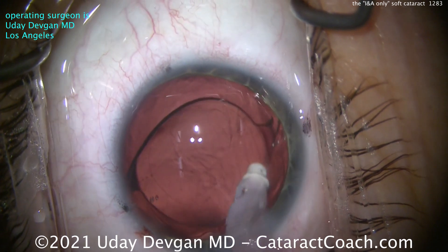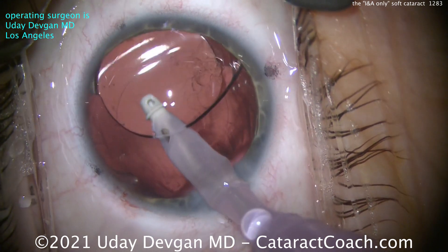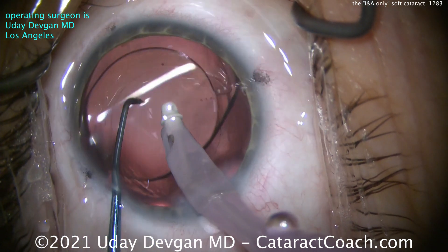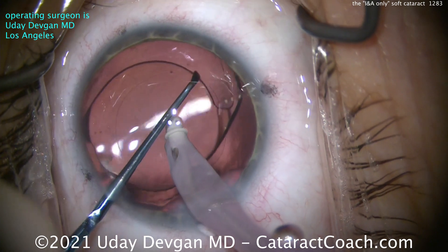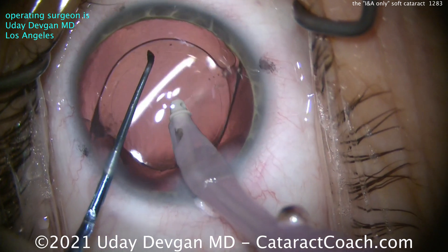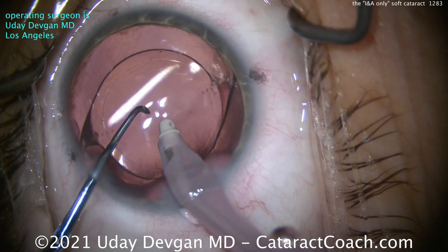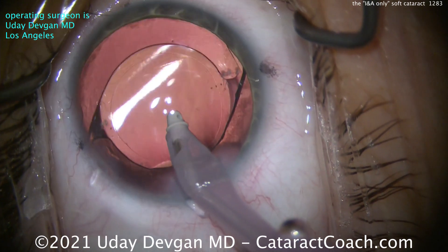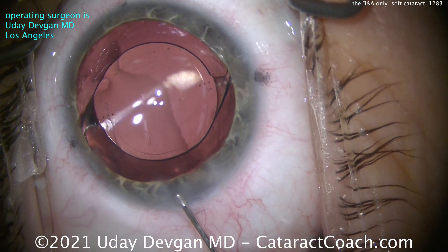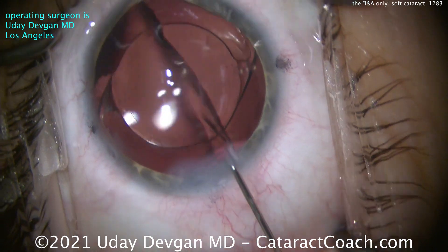In this case, we chose plano. The patient was thrilled. The patient's used to using the other eye — the left eye that didn't have trauma — to do most of the vision, distance and near. This patient spends a lot of time doing driving and outdoor sports and really wants that plano outcome. For any reading up close like cell phone use or a computer, glasses can be used — or even easier, just the other eye. The left eye is completely normal, phakic with great accommodation because of age 30. So in this case, go for plano, even though it's a monofocal lens with no ability to accommodate.